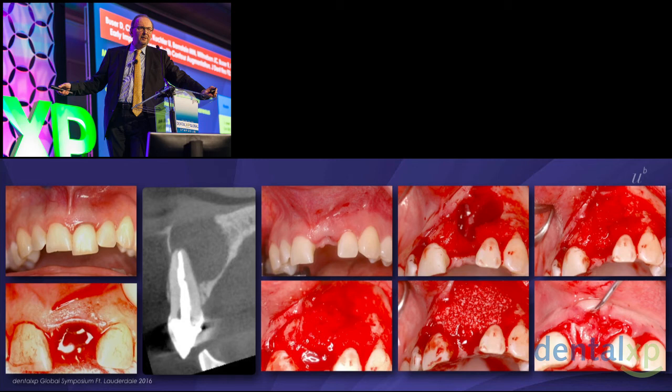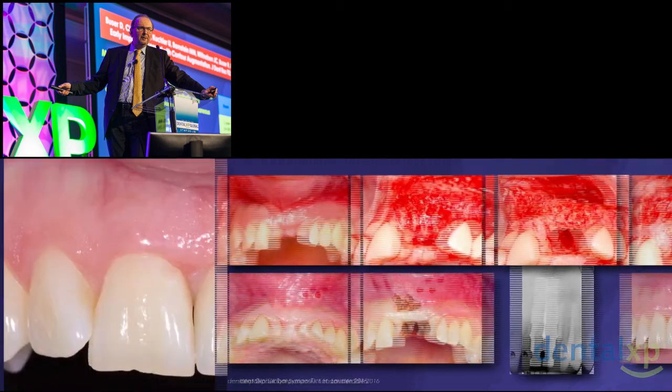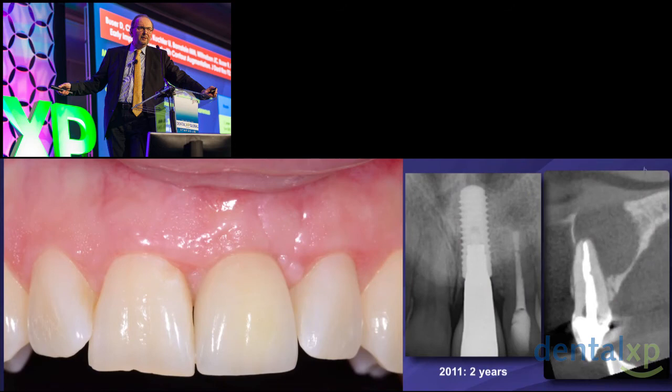And you see, we used the typical fillers and membrane, and then 6 months later, we have been able to put an implant in, see in a nicely healed ridge, and this is then the restoration done by Dr. Wittneben. This is the 2-year follow-up, and I would say quite a decent result when you look at it. I have not seen the lady lately because Dr. Wittneben has given birth to 2 baby girls, and that's how then probably she did not document the case, but I will see that we can do that now.